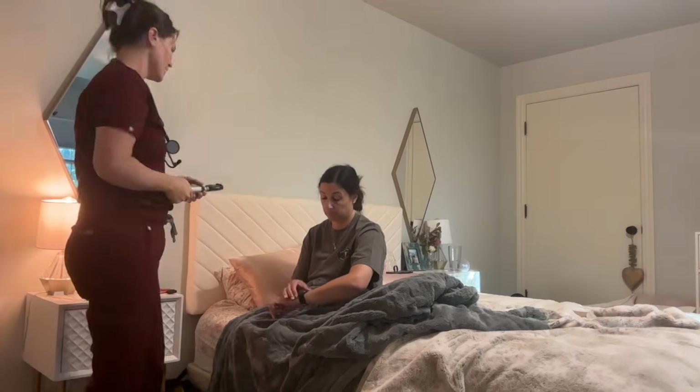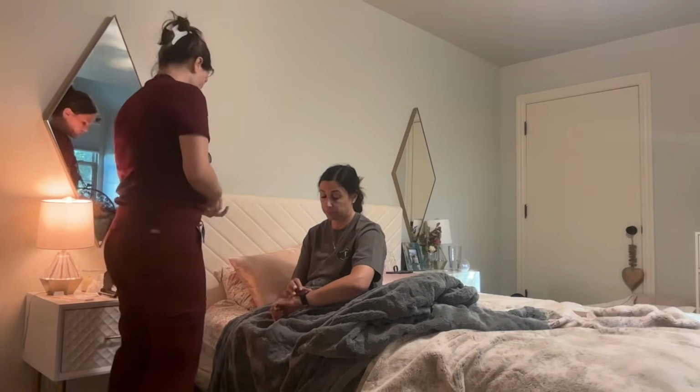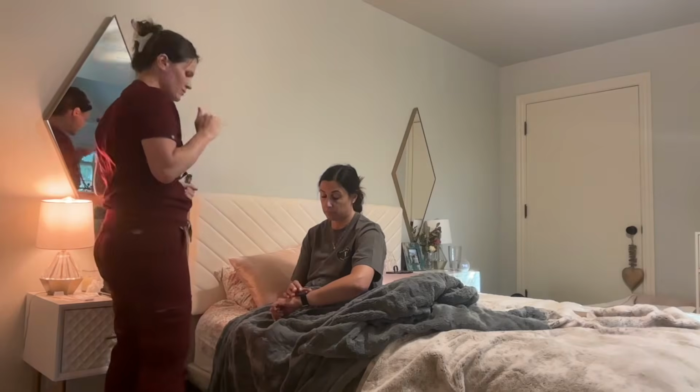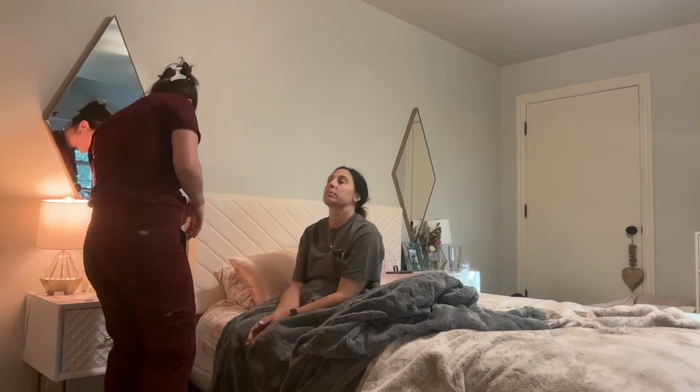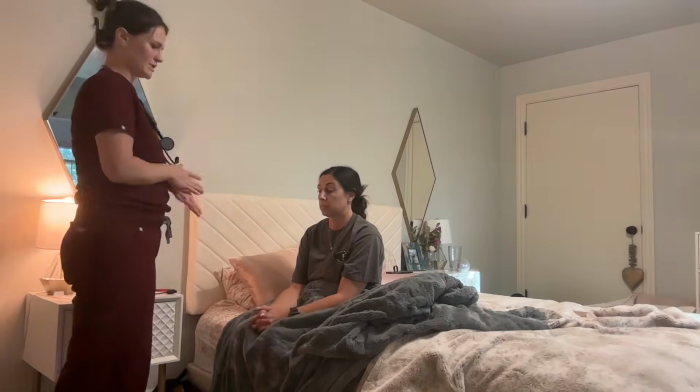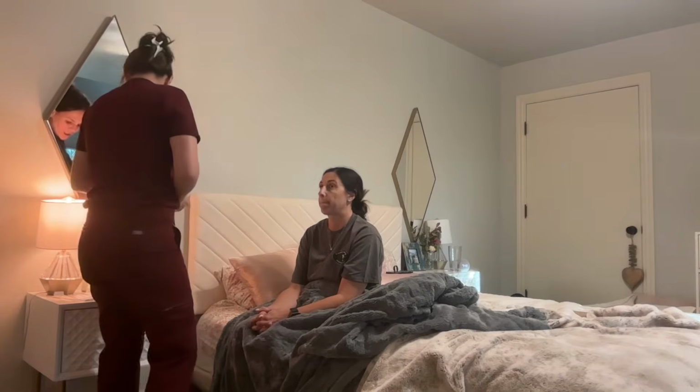We're also looking at the same eye that we are assessing. I am needing to assess it with my same eye, making sure that we are balancing our hand on the head, keeping it nice and still. With her optic disc, it was nice and sharp, no signs of those abnormalities.